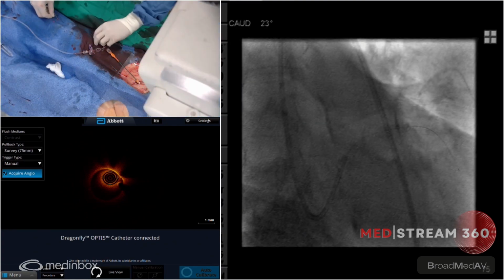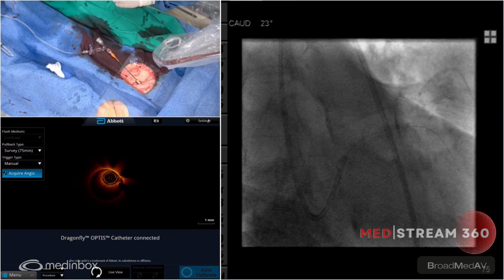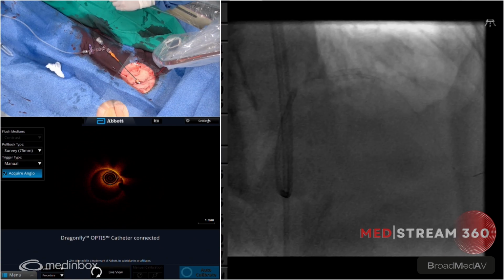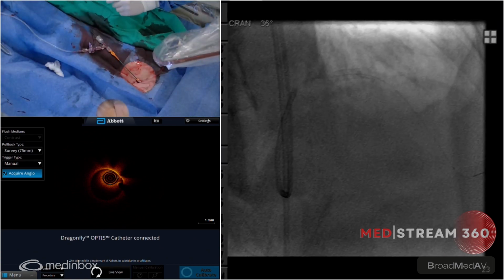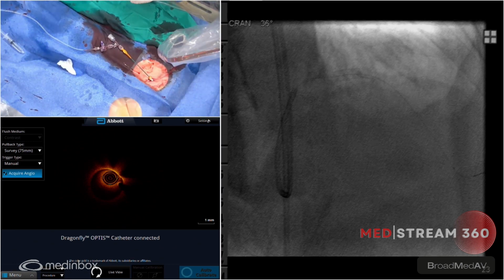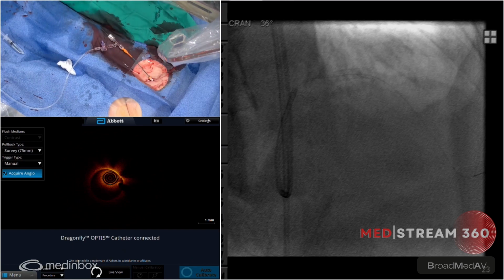Everybody has their own favorite microcatheter for these things. I find, at least with the Turnpike Spiral, it helps you get around some of these angulated lesions and gives you a lot more push. Let's get a 275 trapper, please. Yeah, it's flushed. And now let's get the RotoWire too. I don't know if you guys have it. We'll wait for the trapper.